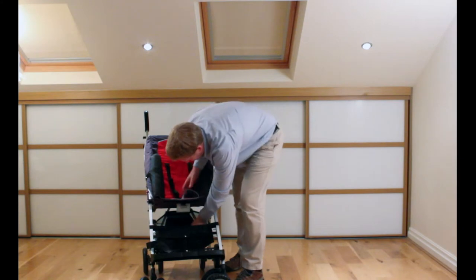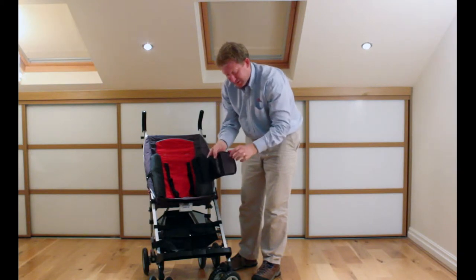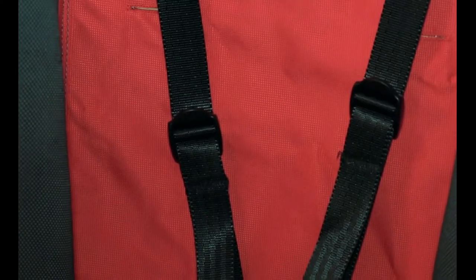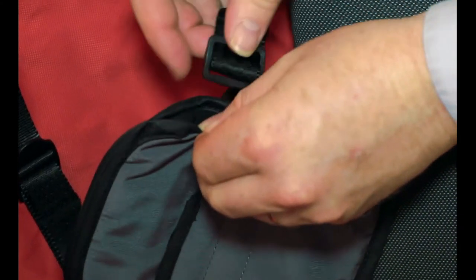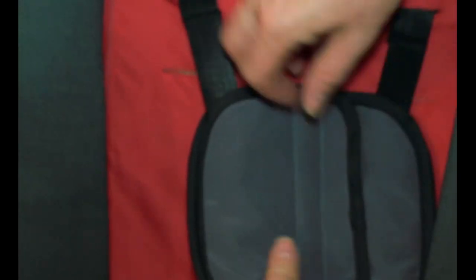Next we'll put on the chest pad. With this one there's velcro on one side and then a fixed strap on the other side. You need to remove the strap and place it through the hole, then pull it through — it also protects against them rubbing against the buckle. Put the strap back through the hole and then put the velcro straps on the other side. It's just a bit of extra padding — it stops them coming off the shoulder and keeps the straps together.